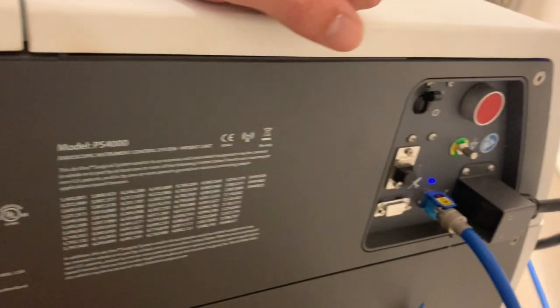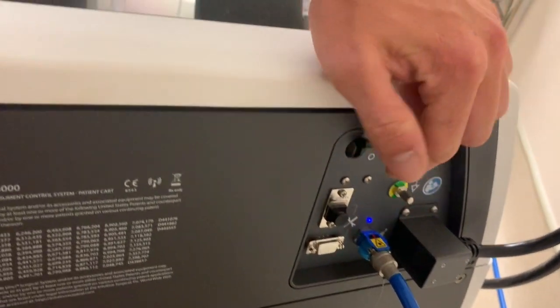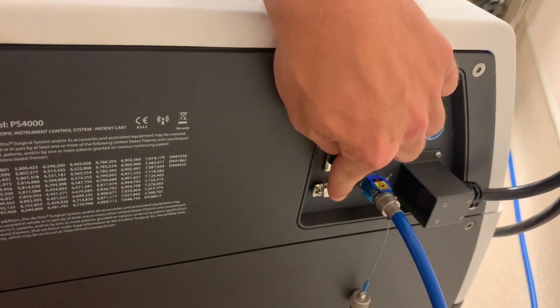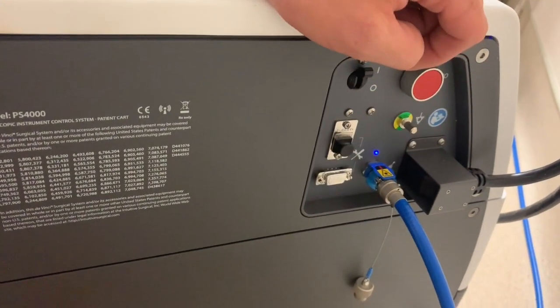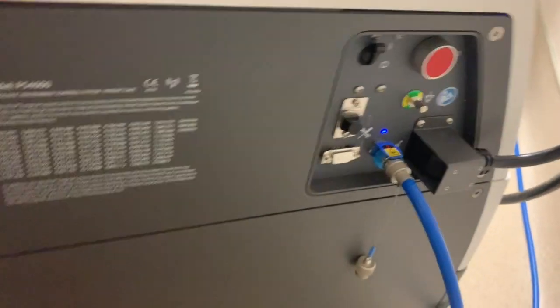Next, go to the back of the robot itself and locate the port for the other side of the cable. There is only one port it will fit into, and it is protected by a metal shield. Remove this shield by the 2 screws at each end and connect the cable to the robot. Check the table menu on the screen on the tower to confirm connectivity.